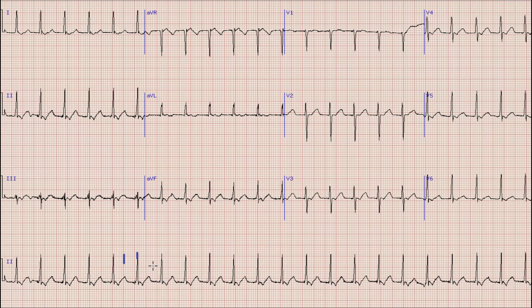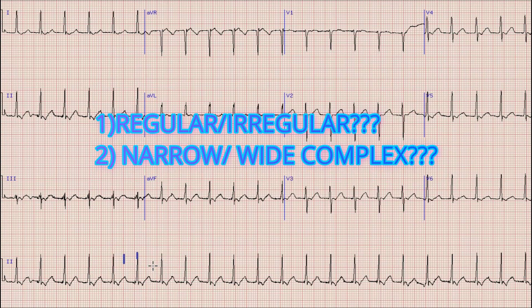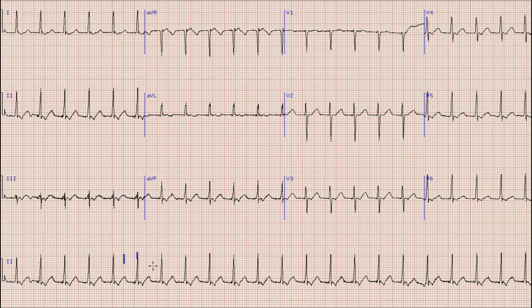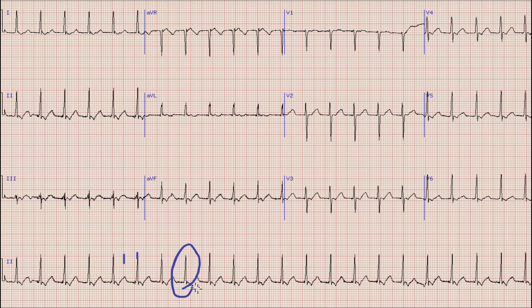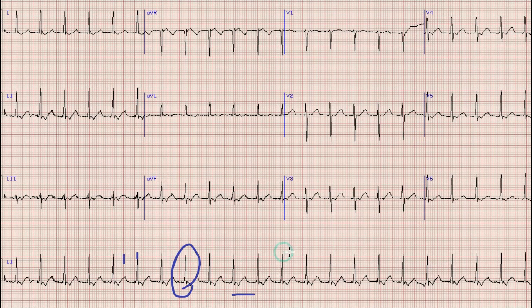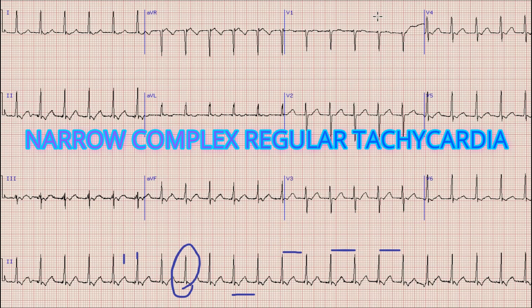Whenever you find a tachycardia, you must ask yourself two questions. First, is it a regular or irregular tachycardia? Second, is it a narrow complex or wide QRS complex tachycardia? Here we can see that the duration of the QRS complex is less than 3 small squares — less than 120 milliseconds — making it a narrow complex tachycardia. The RR interval is regular, so this is a narrow complex regular tachycardia.